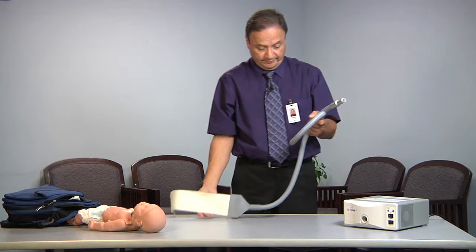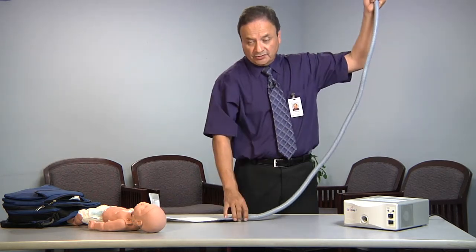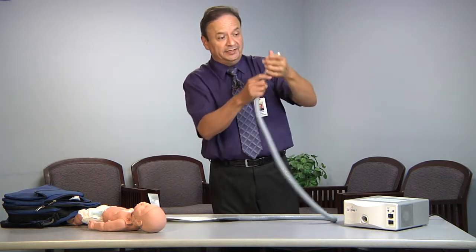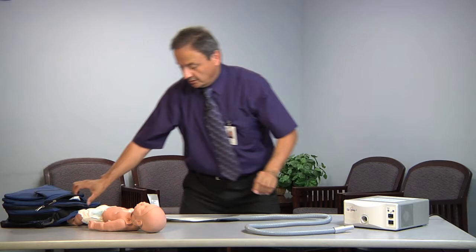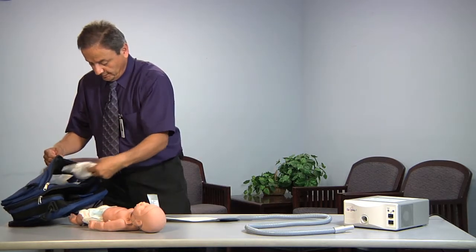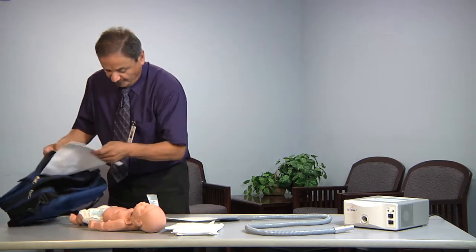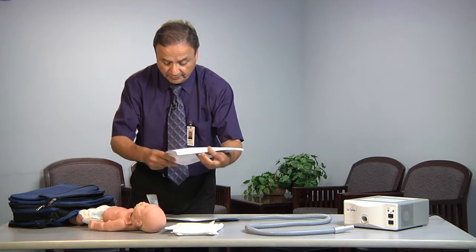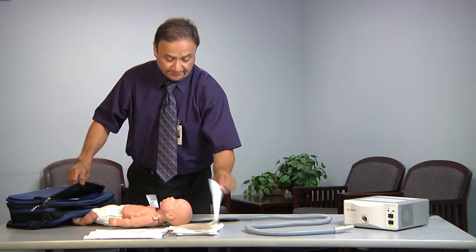This is the pad. This is a fiber optic pad, which means that there is no heat in this tubing, so you don't have to worry about heat for the baby. And this is the part here that will hook in the machine in a second. Also in the bag is some vest and some instructions and some tape.